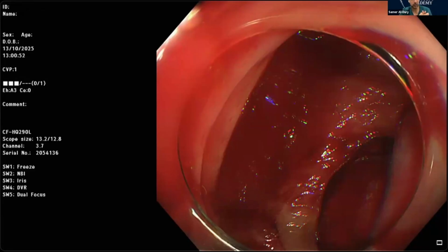And you got this thing where you're grabbing the polyp, it's not cutting, and then there was some tugging, done multiple times around the hepatic flexure. And then I was called in the room when the polyp was off.